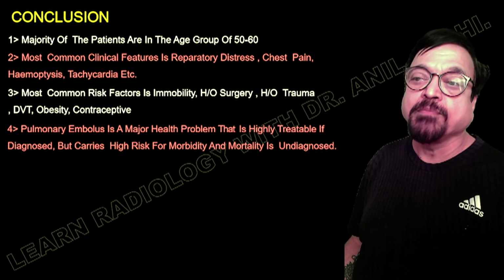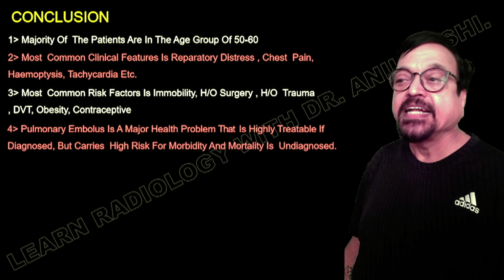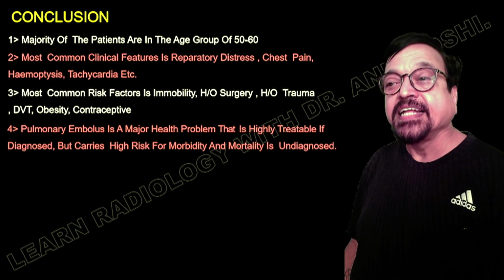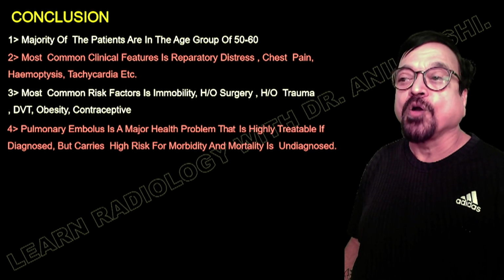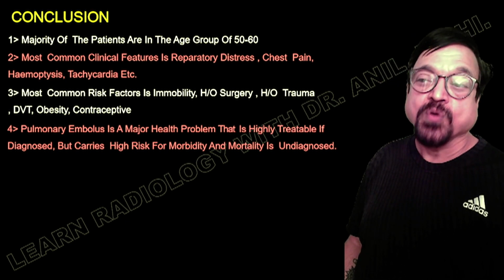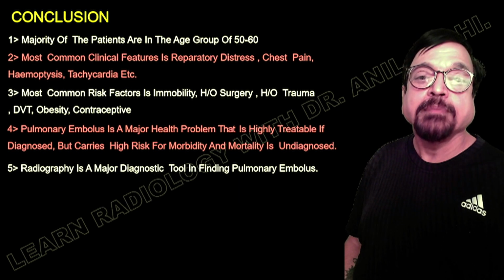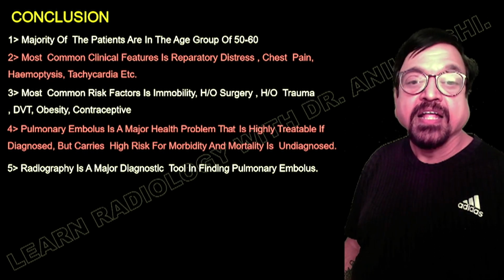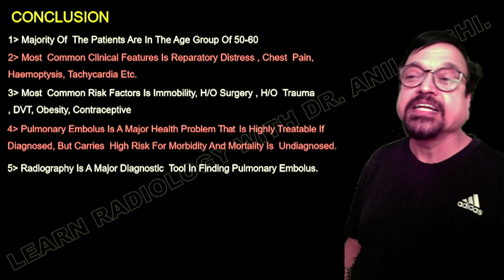Then pulmonary embolism is a major health problem that is highly treatable if diagnosed, and carries less risk, but carries high risk for morbidity and mortality if undiagnosed. So if you diagnose, less risk. If you don't diagnose, it has got very high risk, and because of the overlapping, non-specific symptoms, often it is difficult to diagnose clinically, and it is often diagnosed at autopsy.